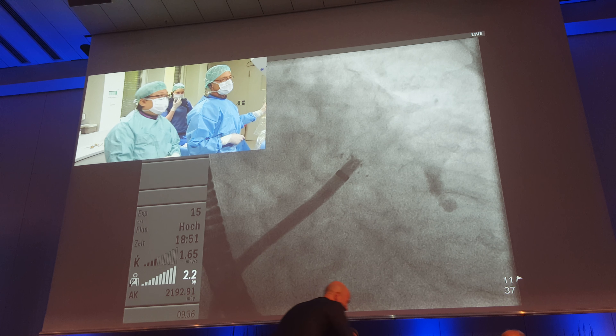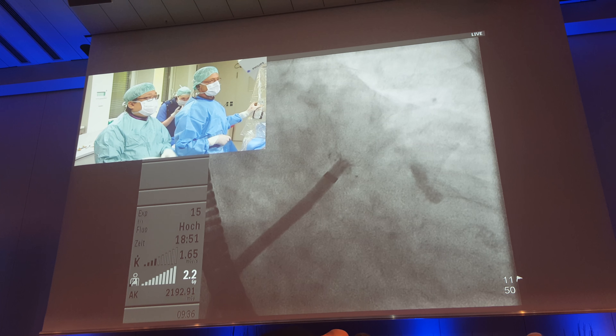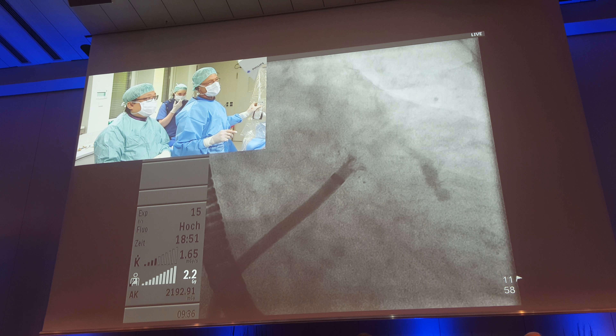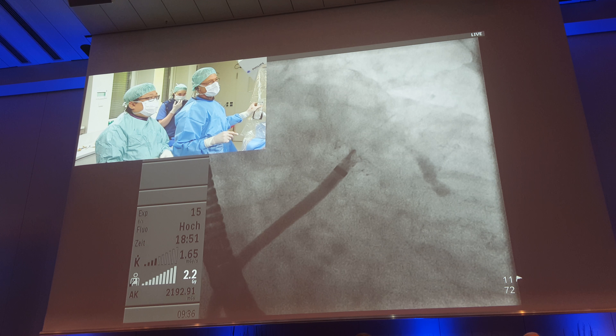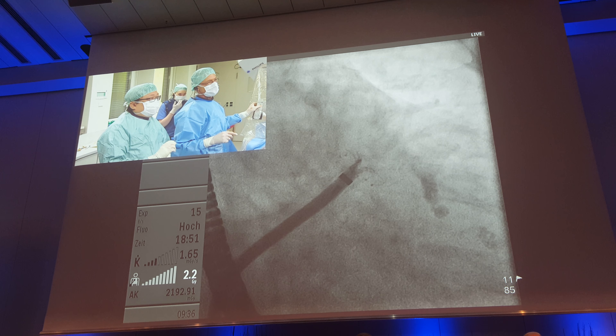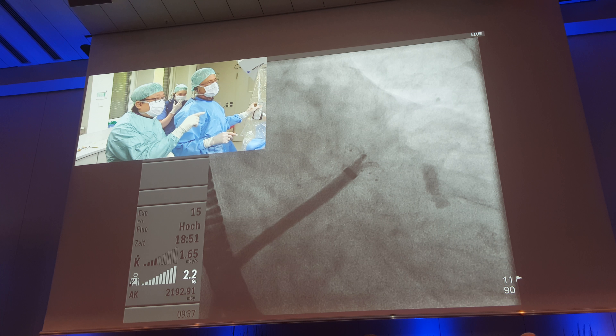Let me forward it first. You see these tiny dots are actually coming down, and now all of them are coming down. But the radio-opaque mark is not coming out yet. You have to keep pushing at this juncture. I don't know if you can notice, there's actually a radio-opaque dot inside the sheath.